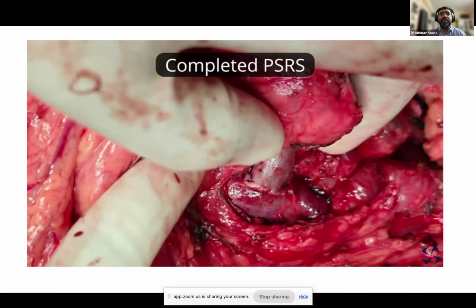But we have generally seen that the vein expands further. So the growth factor is in the last knot which we are tying. One to 2 mm, the knot could be an air knot. So first we take a 2 mm air knot, then subsequently all the knots come over it, so that we give the vein the chance to expand further and then take its shape naturally. That is good.